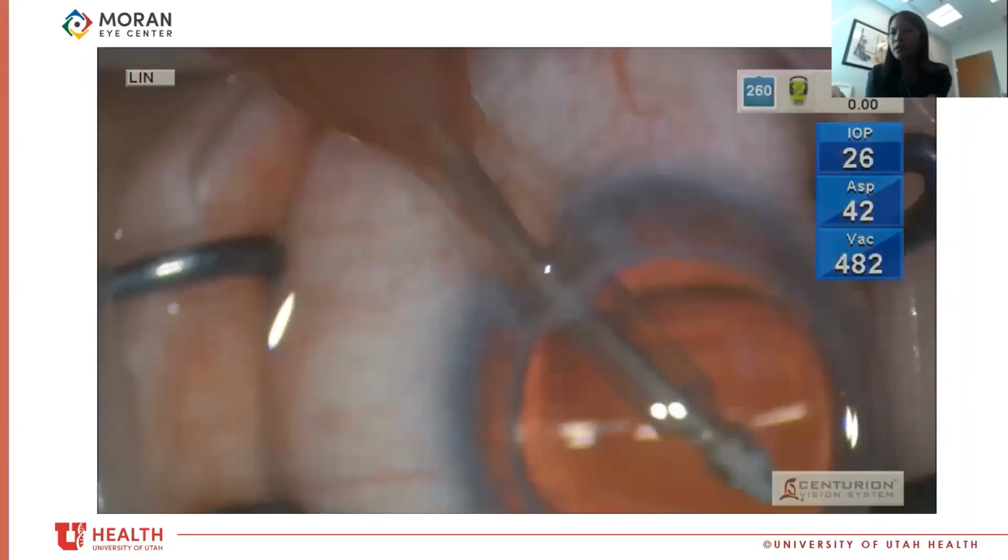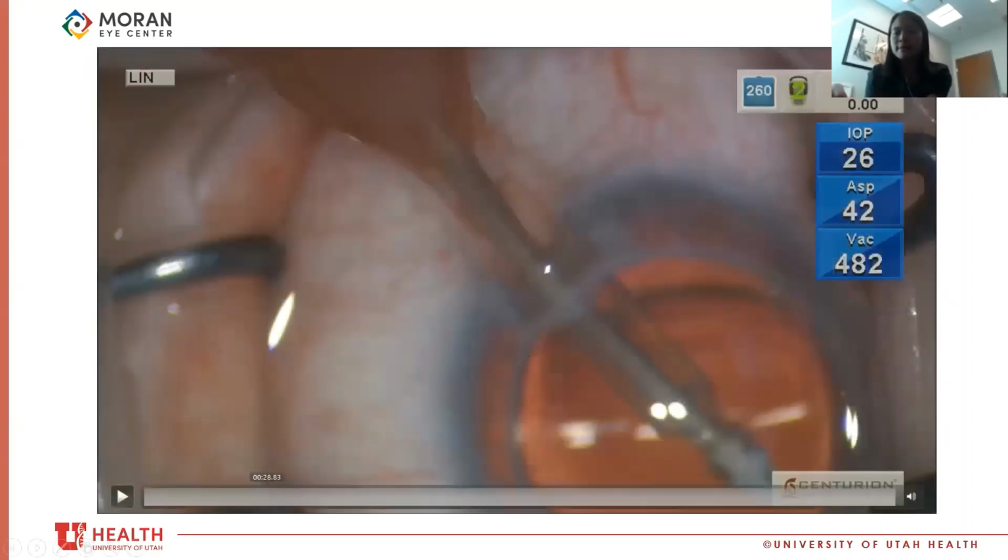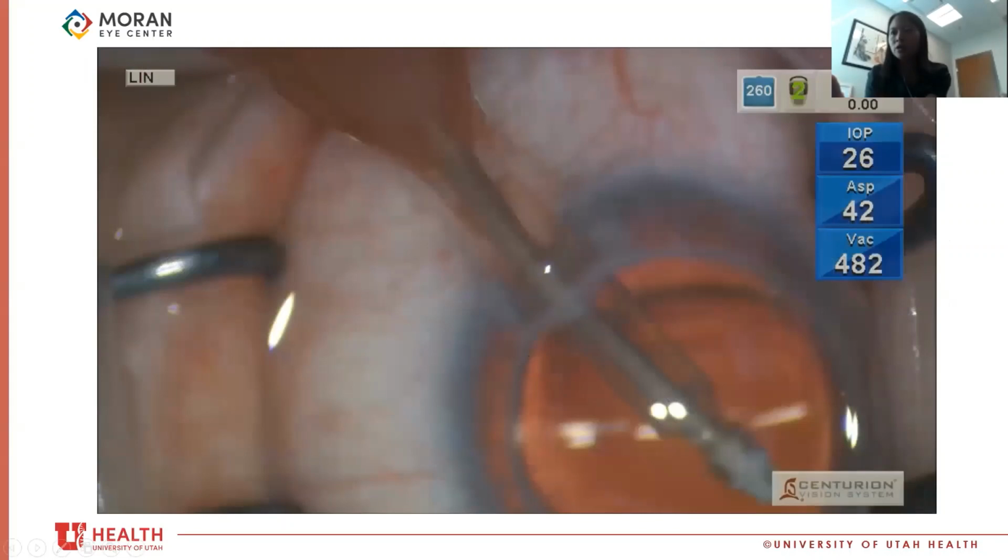Cataract case. So this one actually just happened maybe about 6 weeks ago. Just a preamble. This is a patient who had a PK at least 10 years ago. So it's an old PK.